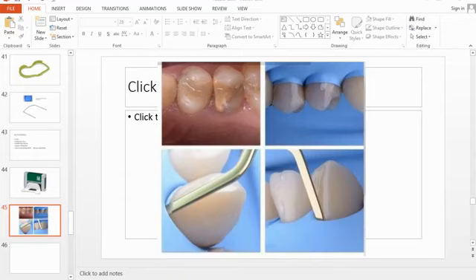So try having the models in which all the teeth are not attached, a little proximal space there, or in models you can create it also. तो try to take models with proximal spaces.